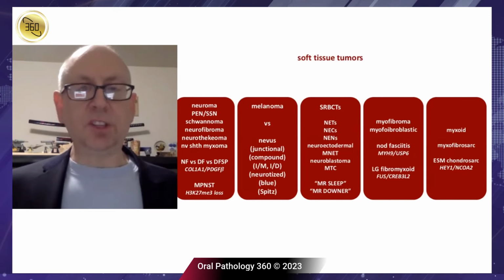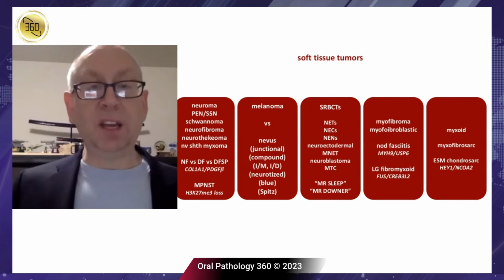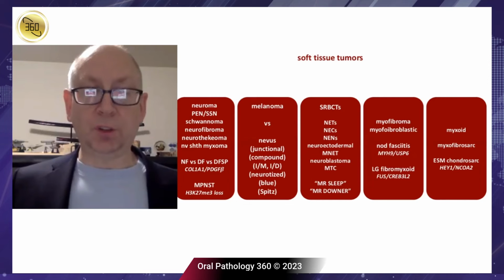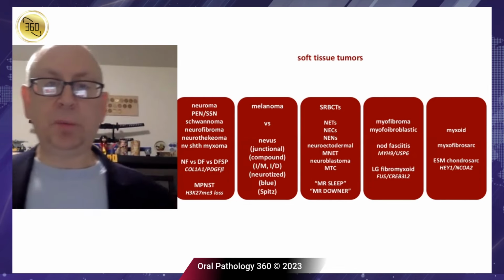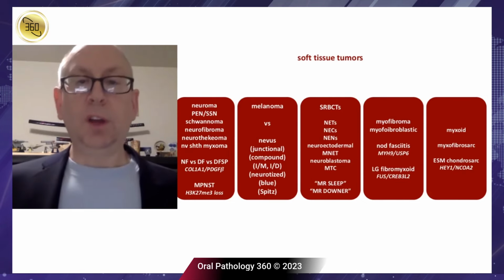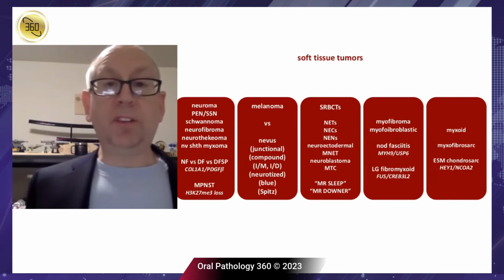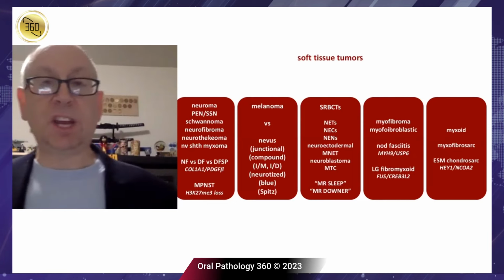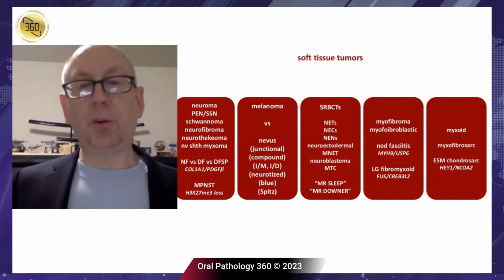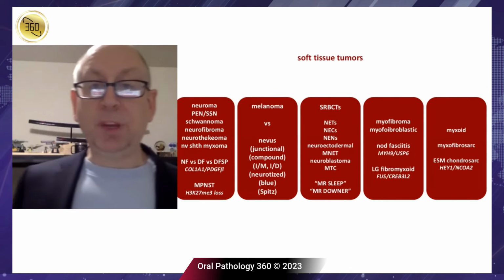Then there's melanocytic lesions that you can view as soft tissue tumors, right? And the challenge is to figure out, is this benign or is this malignant? Then we have all the SRBCTs, right? The small round blue cell tumors that oftentimes will show up in the sinonasal complex. And our job is to tease out either genetically or through immunohistochemistry. And we'll try to talk about that a little. Which tumor is it? Because it matters more and more for not just diagnosis, but for therapy. Then there's all the myofibroblastic tumors. So our job is to figure out, are those reactive or are they the first sign of some low-grade fibromyxoid tumor?